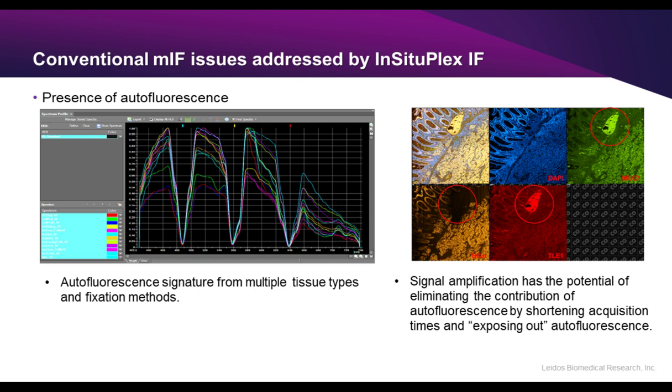Do you really need to look at spatial relationships, say PD-L1 tumor cells and the tumor microenvironment, CD8 cells, etc., adjacent to? Are you looking at relationships between CD31 stained blood vessels and other targets? That's when you start wanting to stack the data on each other.